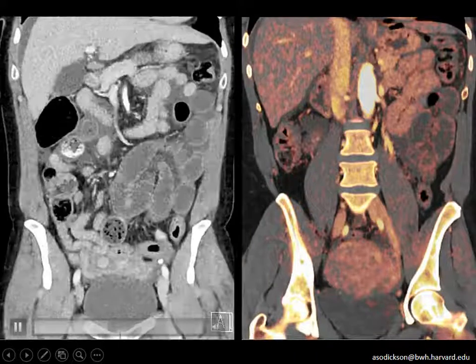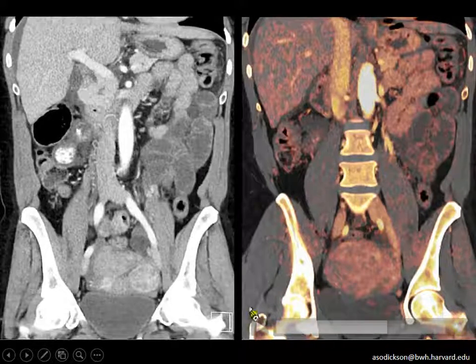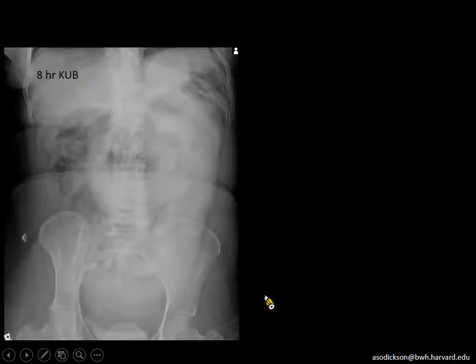We know this because what we often do here in these patients with small bowel obstruction who do not have a very concerning clinical picture is our surgeons have developed a pathway now. After we make the diagnosis of CT without oral contrast, the surgeons give the patient full undiluted contrast by mouth. They wait typically 8 hours and they do an x-ray of the abdomen. The goal of this x-ray is to see whether this contrast has passed into the cecum, which indicates to us that this is a partial small bowel obstruction.